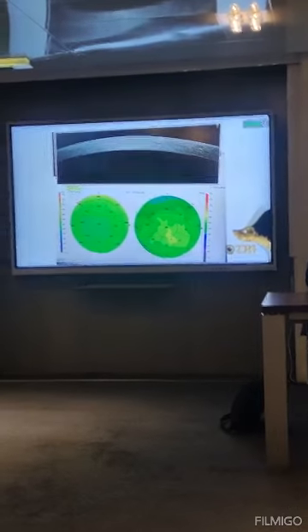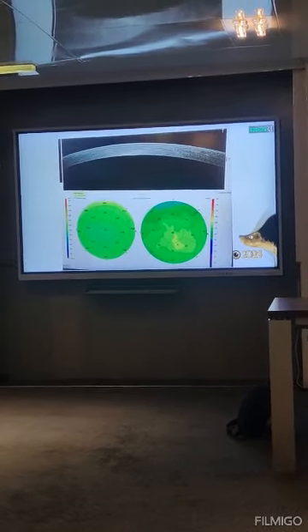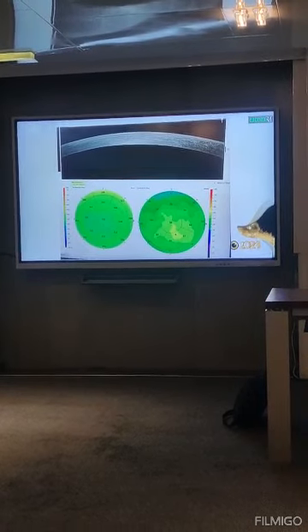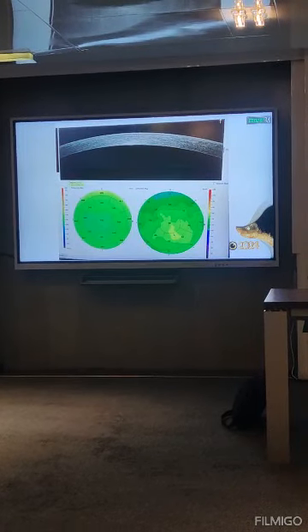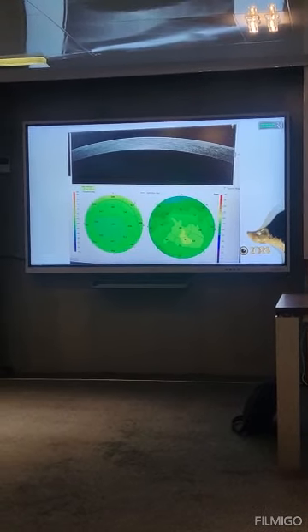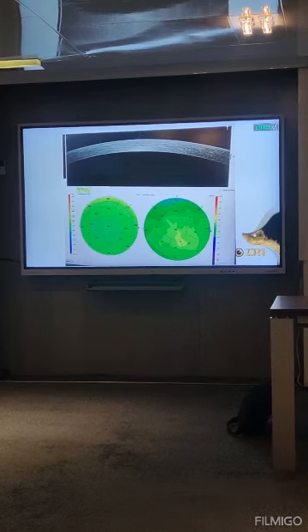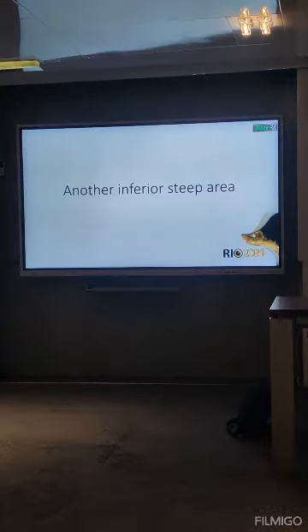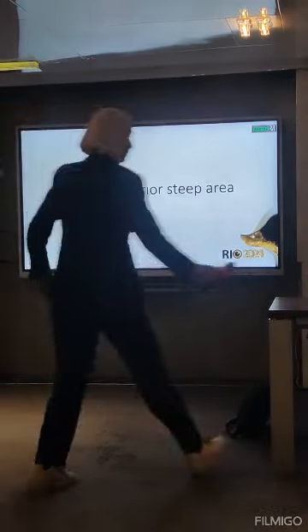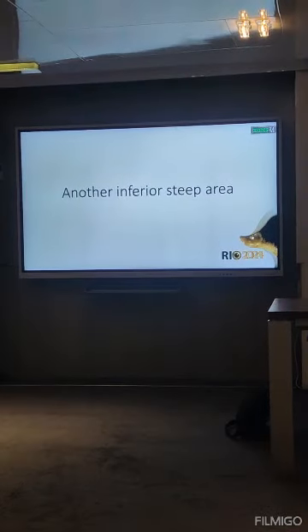Dr. Mazen asked for the epithelial mapping, and this was the clue that solves the problem. There is some epithelial hypertrophy at the area of inferior steepening, which means this is the cause of the artifact that occurs in the Pentacam that showed us this little bit of elevation. Contact lens? She's not, Hosam asked it already. Yeah. Okay. What about another inferior steep area?